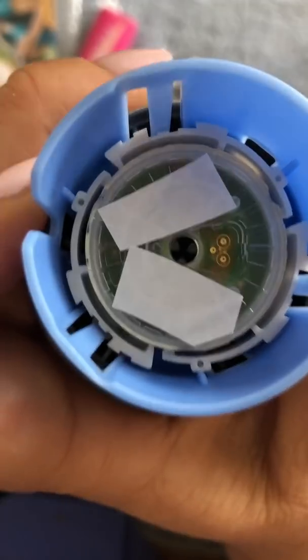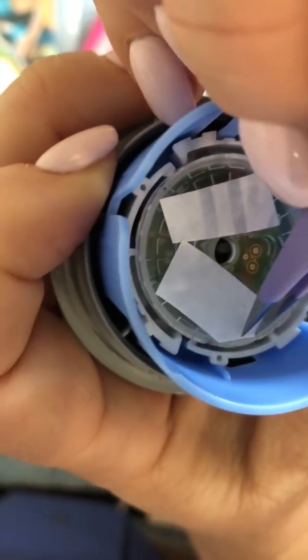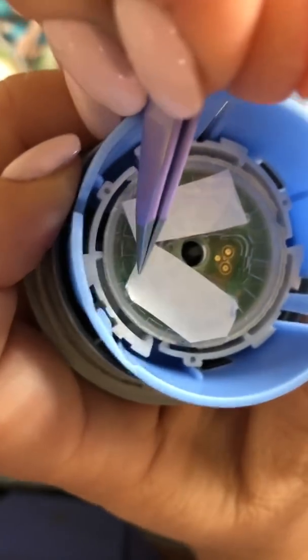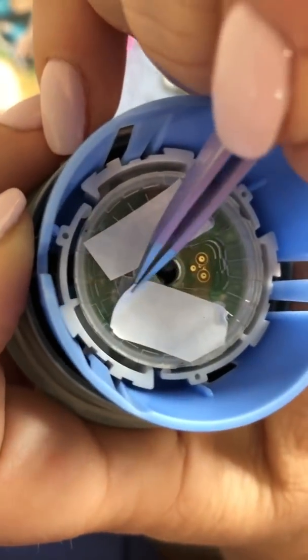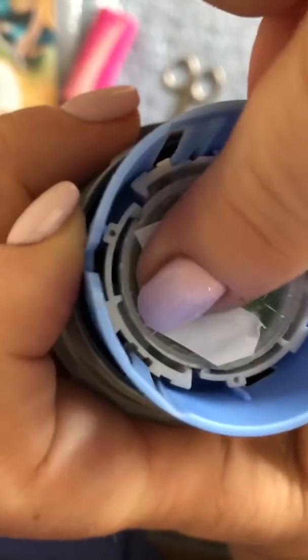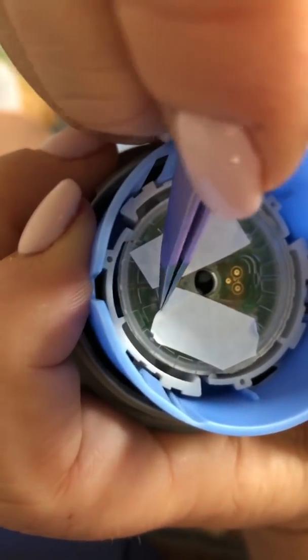So this is done. When I'm done, what I do is I'll take the double-sided tape and I'll work that out, try to get it off. This is a little bit of a challenge too, because you don't want to pop it out. So there we go. Okay, so I'll take that off. Well, it looks like I got the tape on that one, so let me stick it in just a little bit harder. See if I can get it in there.